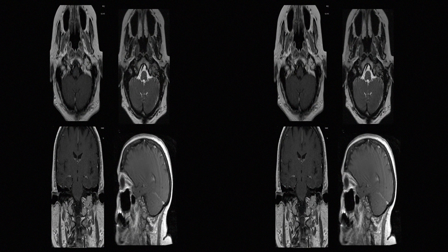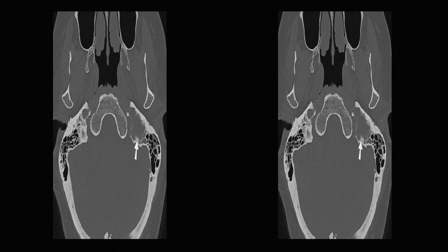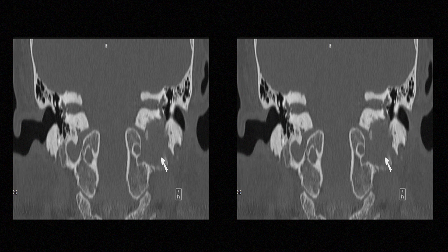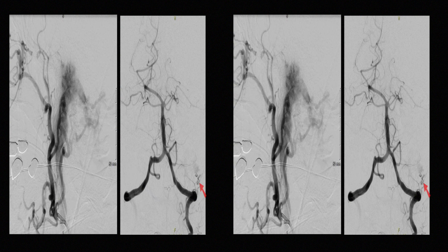The case presented is that of a 65-year-old lady who presented with pulsatile tinnitus, normal lower cranial nerve and facial nerve function, and intact hearing on the left side. Neurodiagnostic studies including MRI and CT scan revealed a 3-centimeter glomus jugulare tumor with destruction of the mastoid bone primarily and the region of the jugular bulb. The cerebral angiogram demonstrated significant blood supply from both the left external and vertebral arteries, typical of a glomus jugulare tumor, with no blood supply from the internal carotid artery.